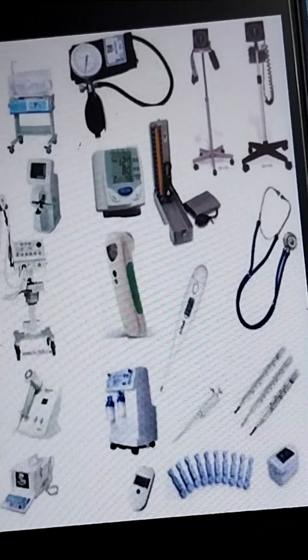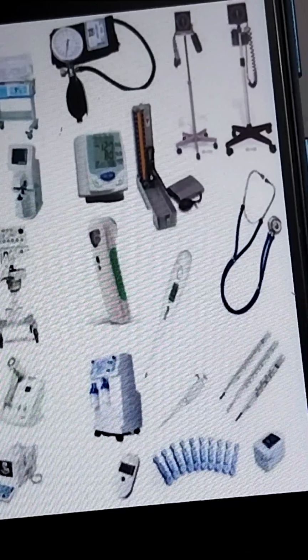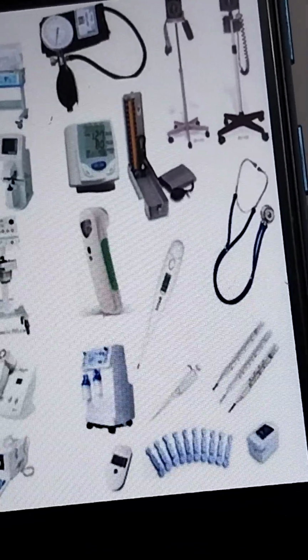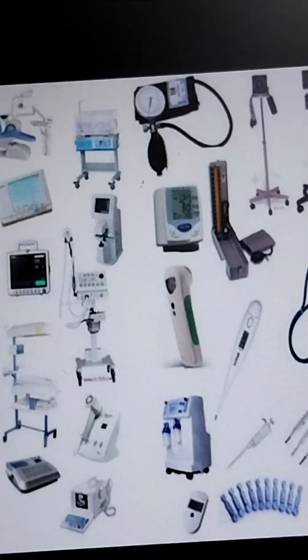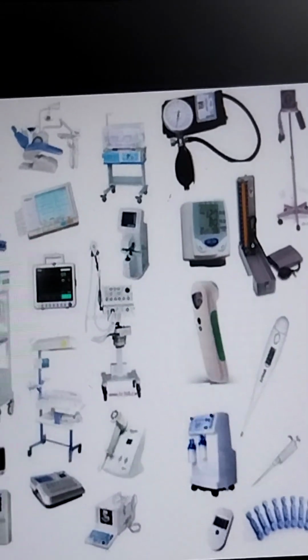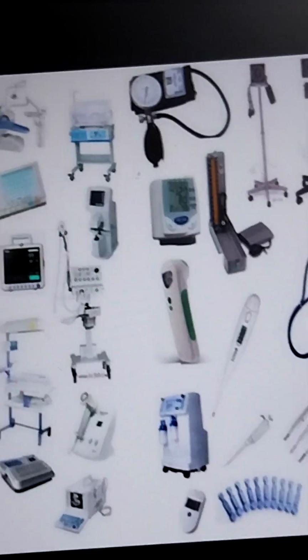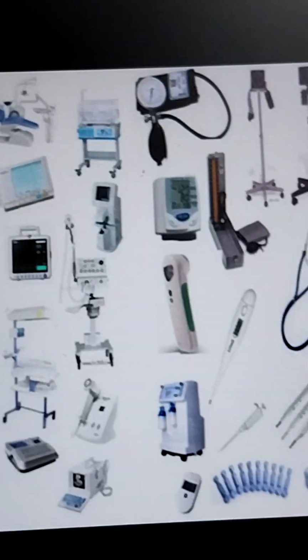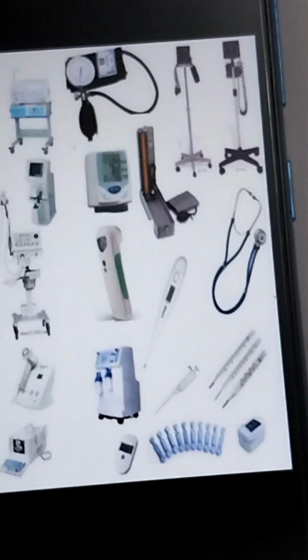While all of the hazards listed are important, the prevention of many of them requires methods peculiar to the particular type of equipment under consideration, especially electrically operated equipment, which needs to be protected from short circuits and needs appropriate calibration so that the appropriate output is achieved by the instruments.